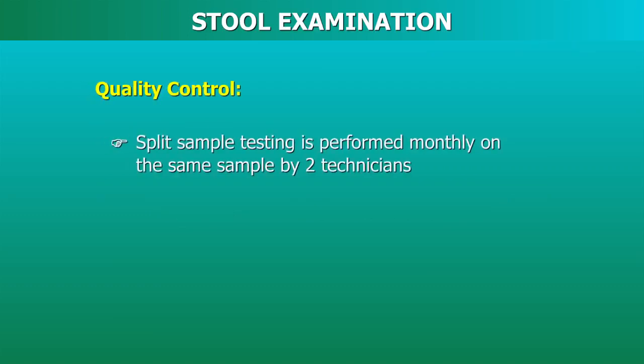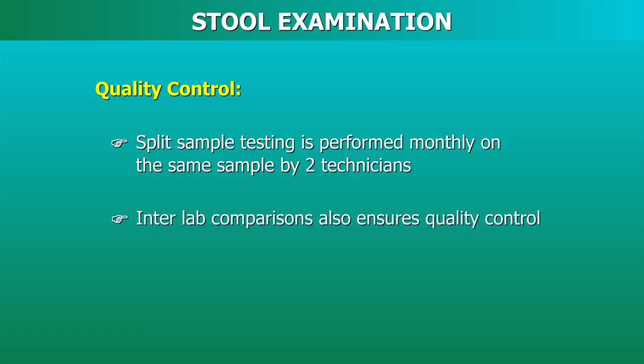Split sample testing should be performed monthly on the same sample by 2 technicians. Inter-lab comparisons is another method of ensuring quality control.